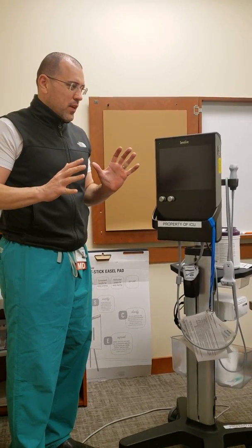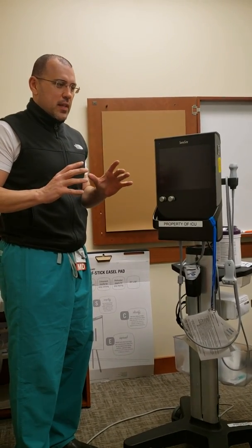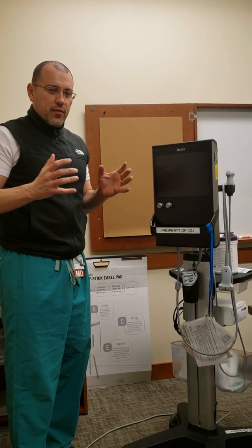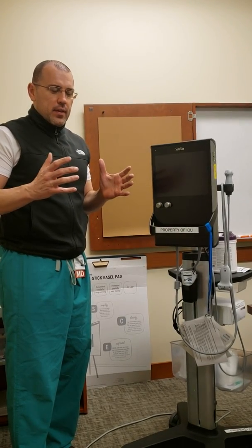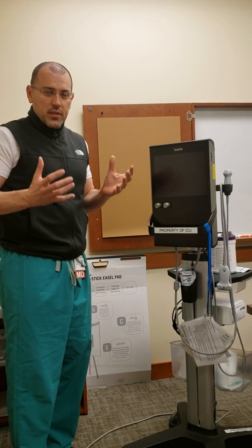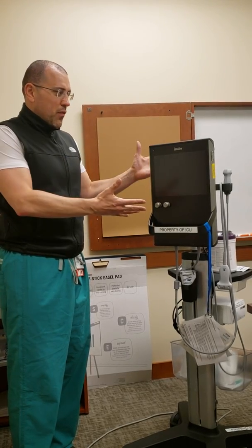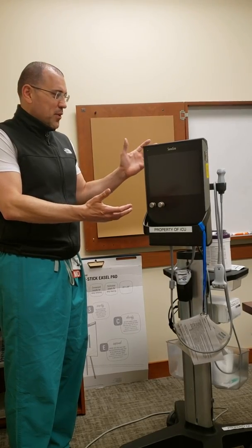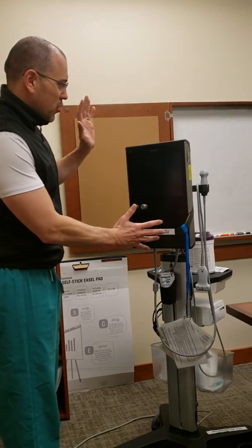I wanted to make a short video about our ultrasound because now since everything is ultrasound guided, it's difficult for the physician to just do this by themselves — it's a team effort. This often ends up becoming the responsibility of our nursing staff, so I wanted you to be familiar with it. This is our SonoSite machine.